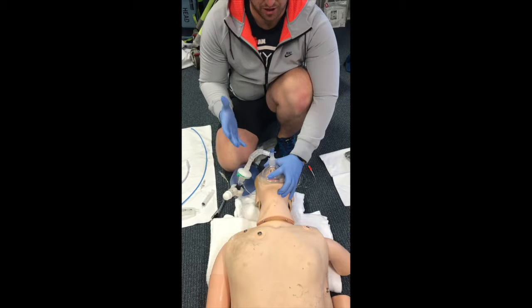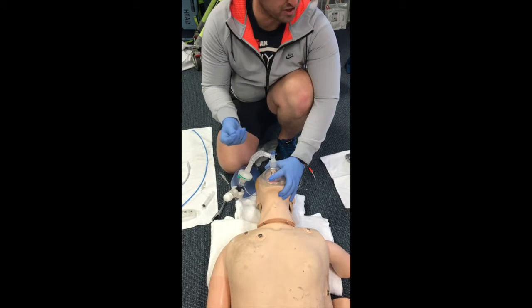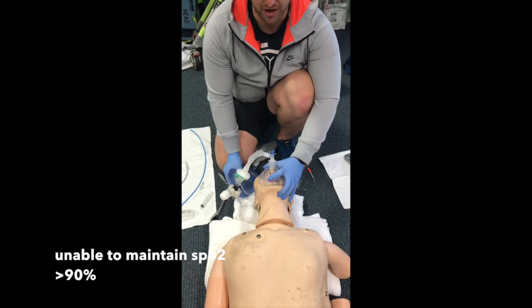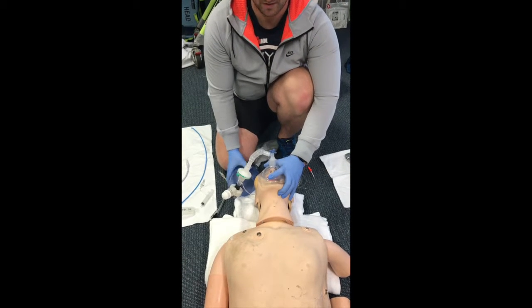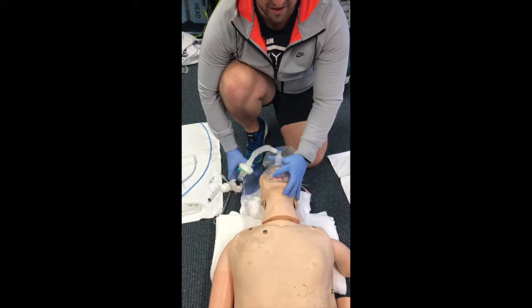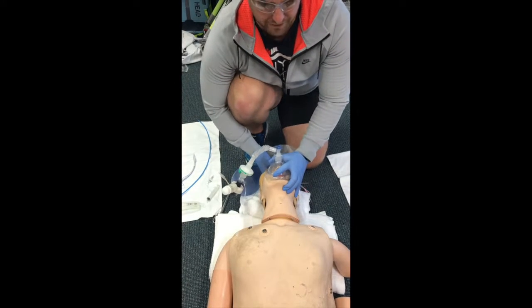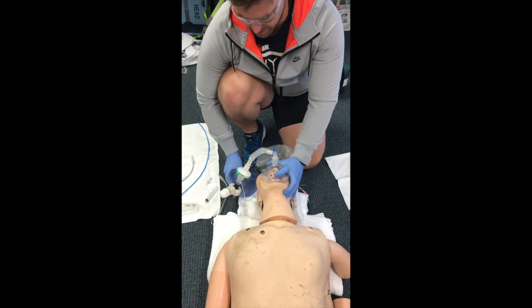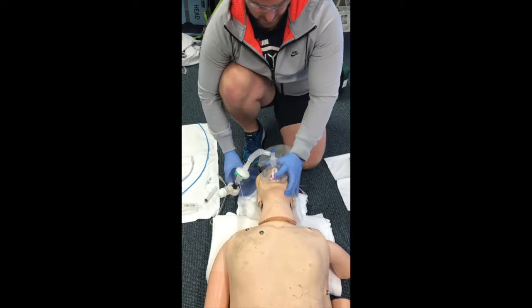And at this stage, I notice that I'm unable to get rise and fall of the chest. The SpO2 is continuously falling, and I can't oxygenate, can't ventilate this patient. So I've made the decision that I'm unable to oxygenate and ventilate my patient with a Goodell's airway and a BVM. So I need to move on to the next step.